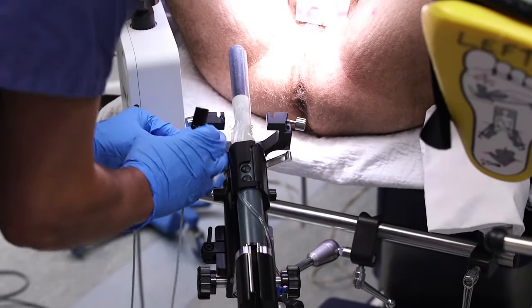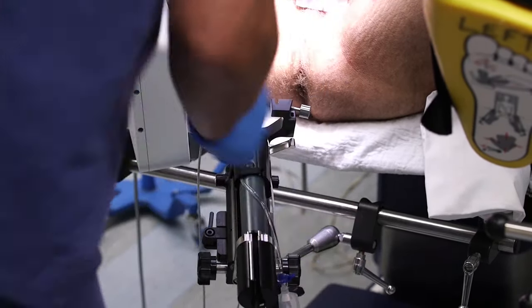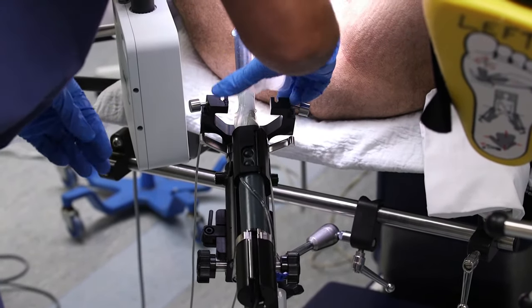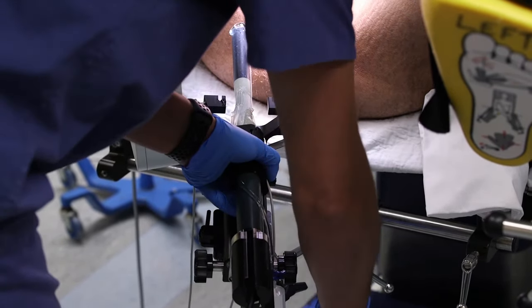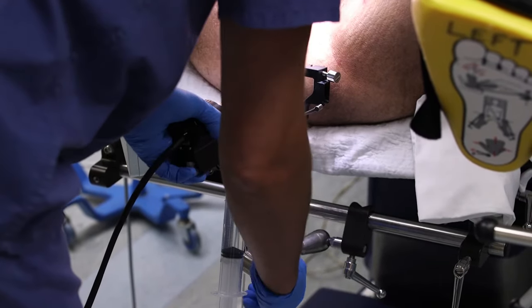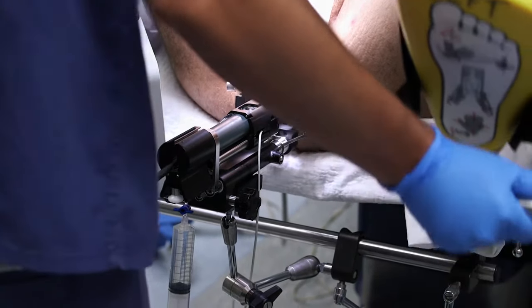The loaded stepper is then loaded onto the stepper holder at the bed. The trackers are loaded onto the sides of the stepper holder. Ultrasound gel from the Tumi syringe is applied to the ultrasound probe tip and inside the rectum. The ultrasound probe is then inserted into the rectum and the stepper arm is tightened once in place. The scrotum is taped towards the abdomen to expose the perineal skin. Lastly, the legs are raised to move the patient's pelvis prior to fusion.